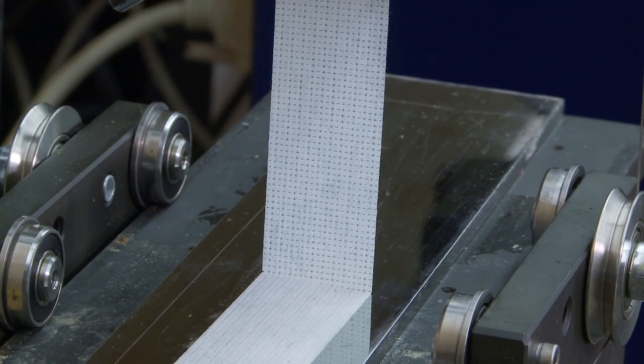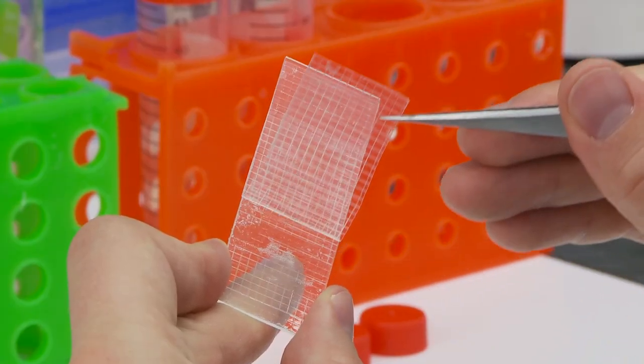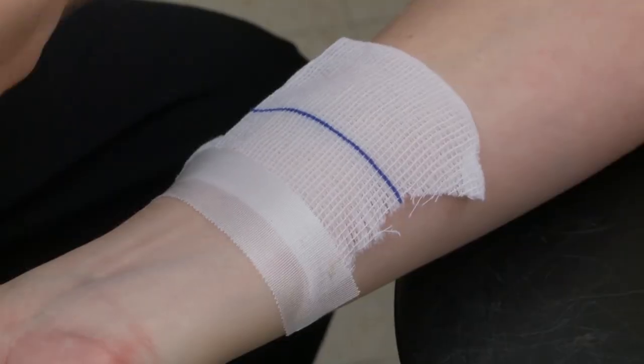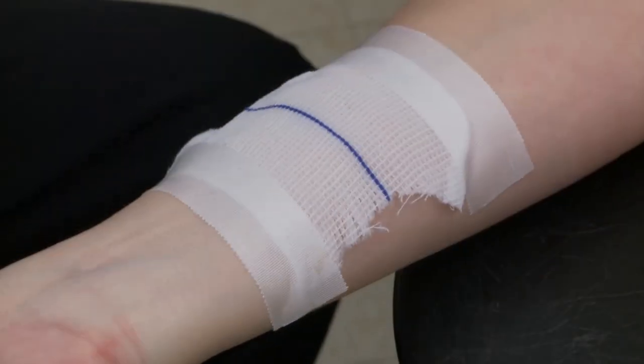It could help the 1.5 million patients per year who are scarred from medical tape. Science creates an ouch-free solution to a painful problem. I'm Josh Lebowitz reporting.